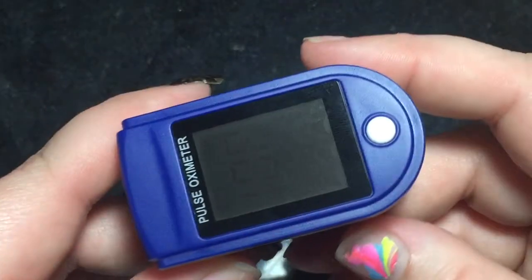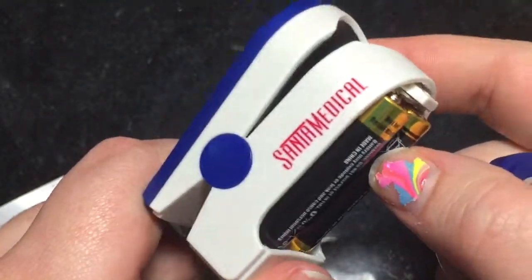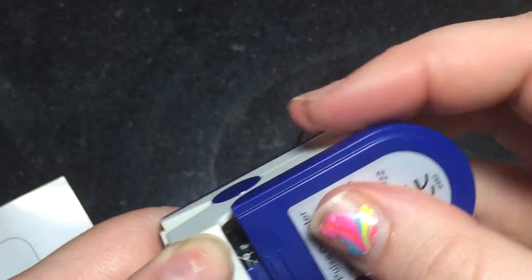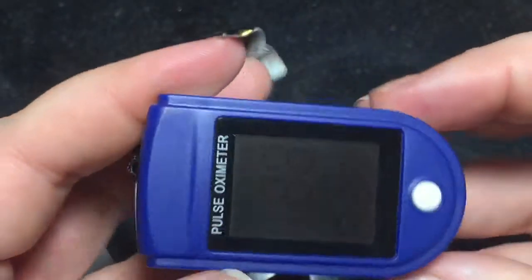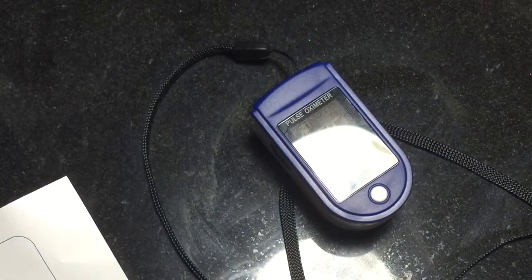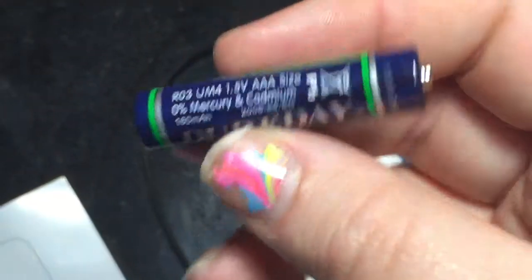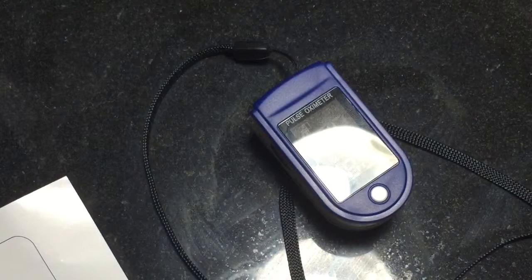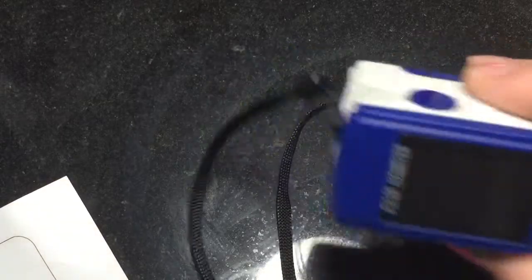It's pretty easy to put together — it has a back that just kind of slides off and uses two AAA batteries, then clicks back into place. Something I did notice was I had put some batteries in, which were actually the ones that came with it, and after only a few uses it sat in its pouch for about a week after my surgery, and when I went to use it again the battery was dead.